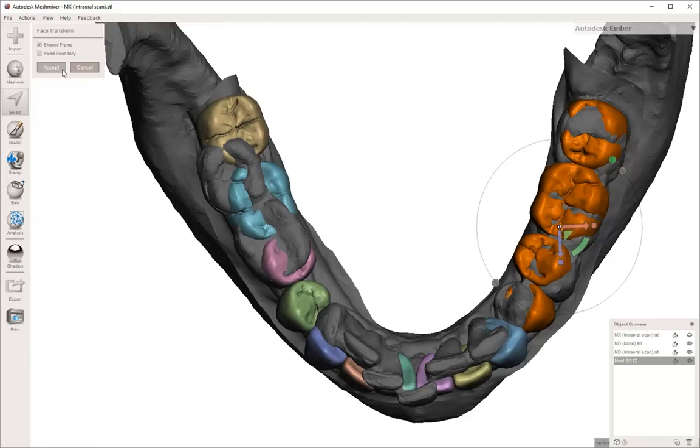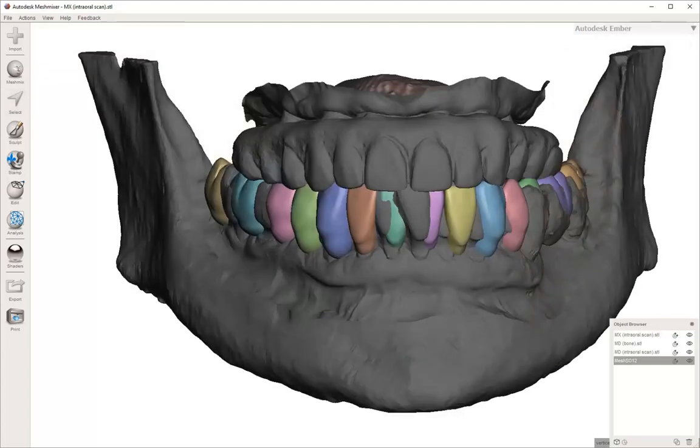As you can see, you can start to move just the teeth that are selected and the other ones stay in the same place. Once you get them where you want them to be, you can accept that and then start to look at the occlusion.